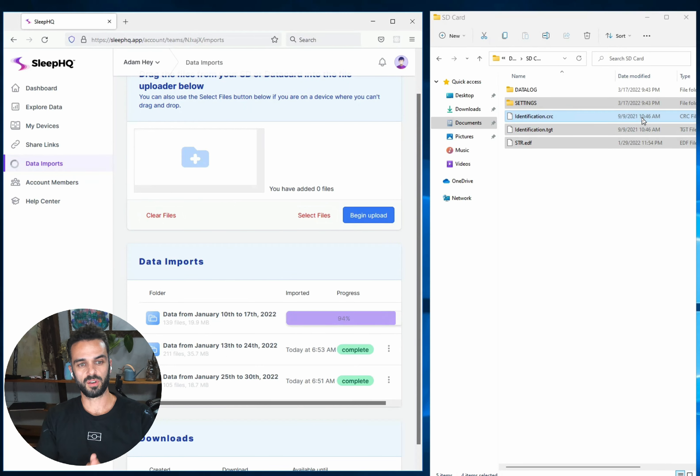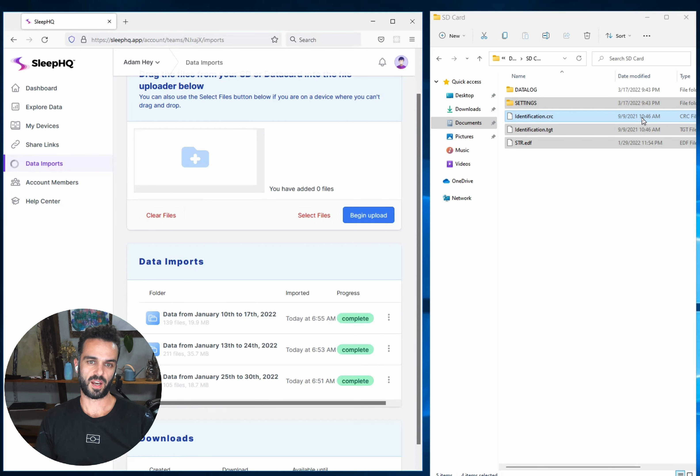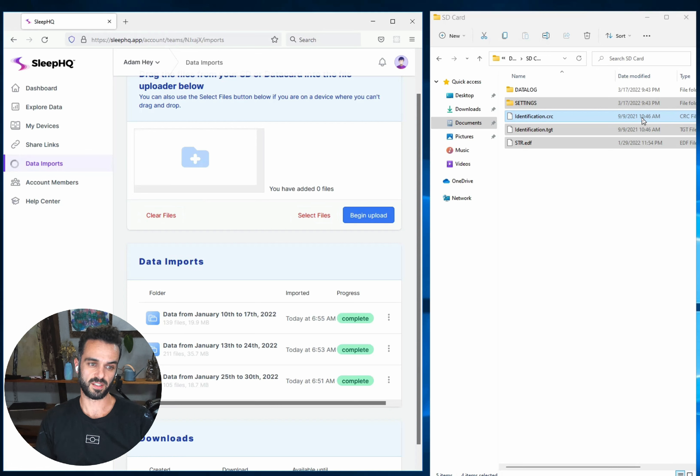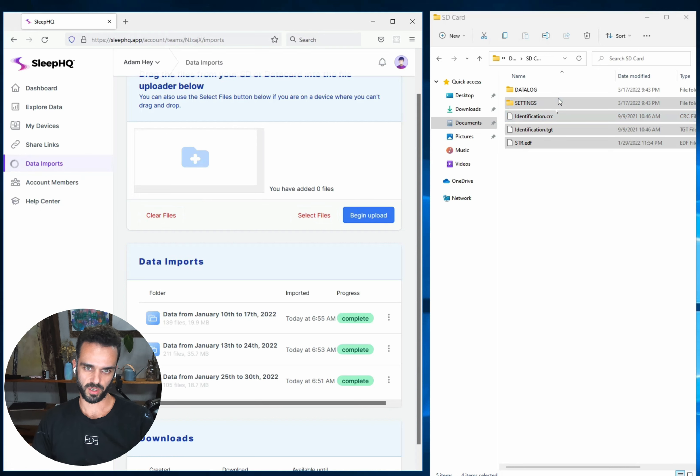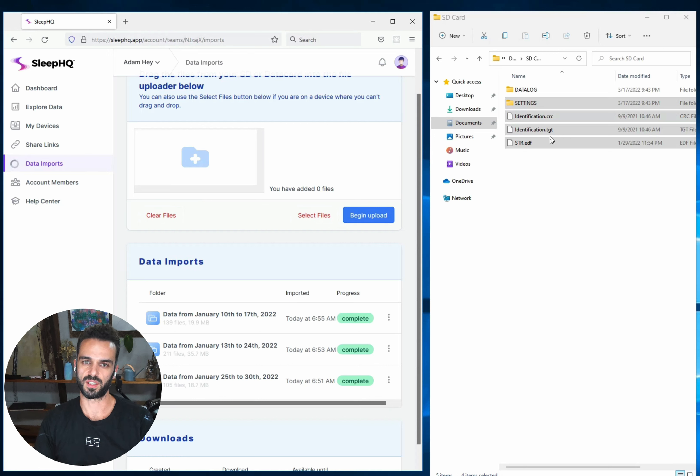So again, going forward, when you're coming to upload your most recent data, you can just grab the most recent three, four, five days, however long it's been since you've done an upload, drag them all in, make sure you grab your identification files as well. And then it doesn't matter if you've duplicated some of them because the system is just going to figure out which ones it actually needs to process every time it runs.